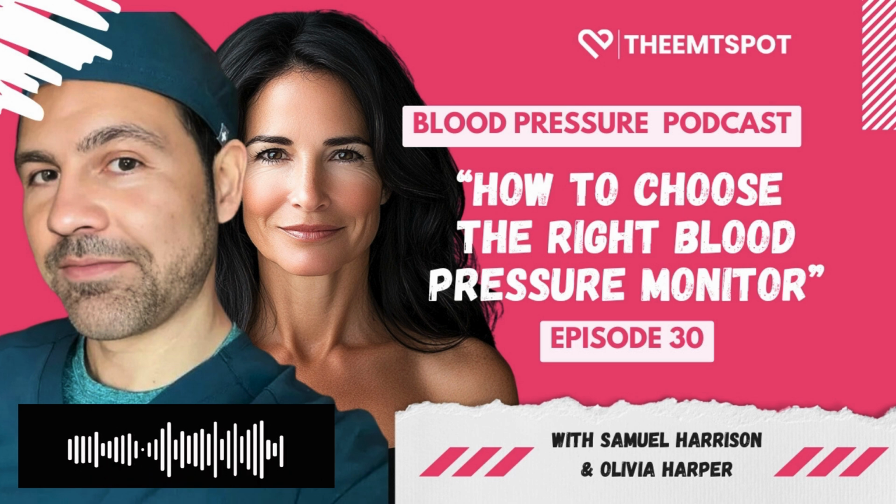I like that. So let's say we're convinced. We want to get a monitor, but then we see all the different types. It gets a little crazy. You've got your manual ones, the old school kind, like something out of a vintage medical drama. And then there are the aneroid monitors, the ones with the dial. A little bit of old school charm there. But of course, we've got to talk about the digital ones too. Those are super popular for a reason. Sleek, modern, easy to use. It's like choosing between a vintage record player, a reliable cassette deck, or a modern streaming service.